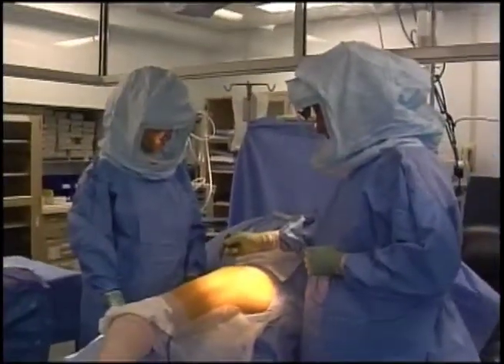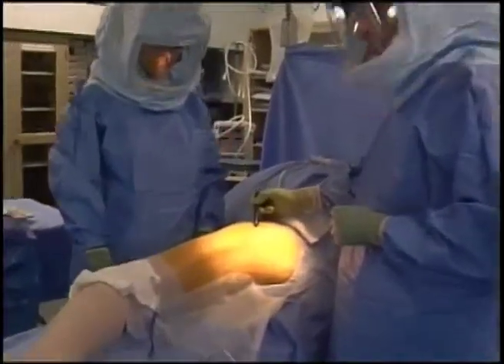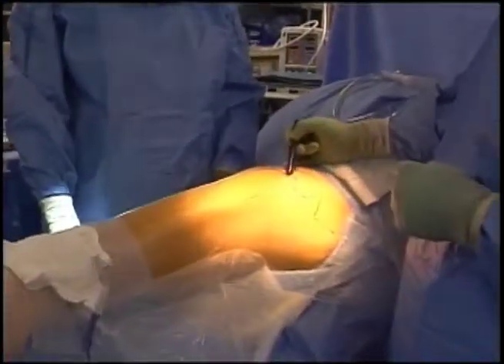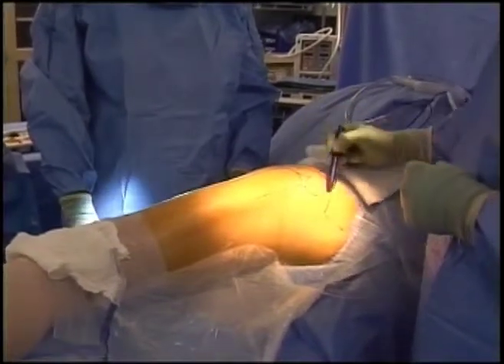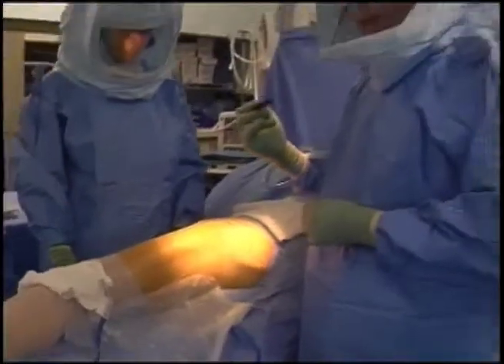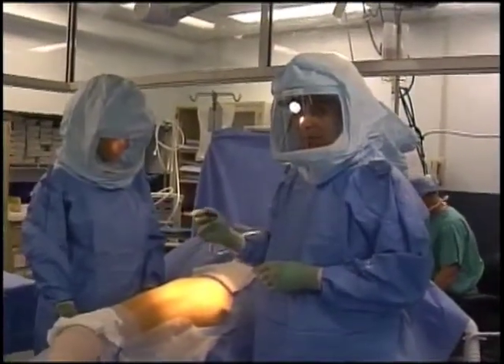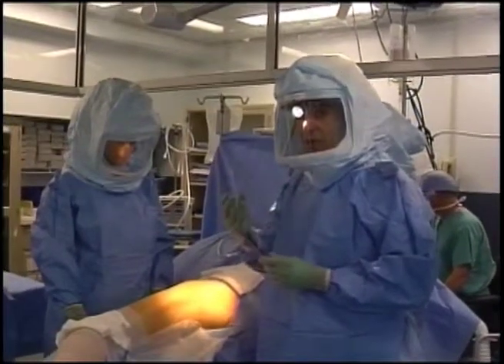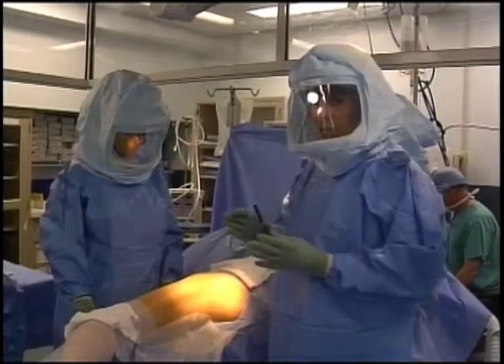I've marked the patient to orient you. This is the top of the patient's thigh bone, a portion called the greater trochanter, the neck of the hip bone, and then the ball or the femoral head. This is the acetabulum or the socket of the hip. The reason I'm wearing a headlight is that the approach I use is a minimally invasive approach — a minimized skin incision — and the headlight helps me to see in what is a fairly small surgical incision.